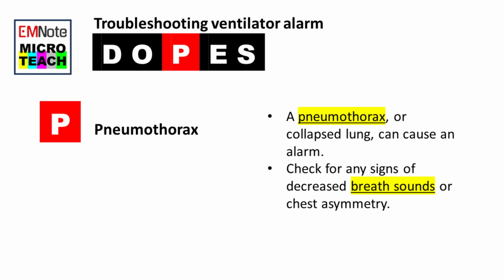And I remember reading that bedside ultrasound can be super helpful here. Oh, absolutely. POCUS, point of care ultrasound. It's become indispensable. Lets you see what's happening in those lungs right then and there. Faster diagnosis, faster treatment. Exactly.